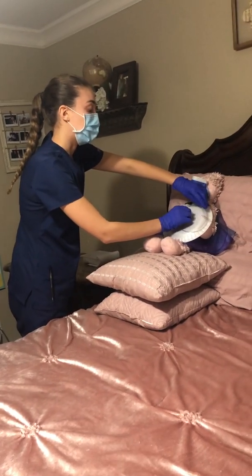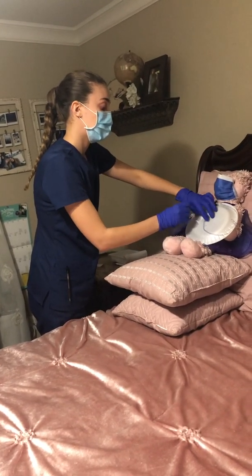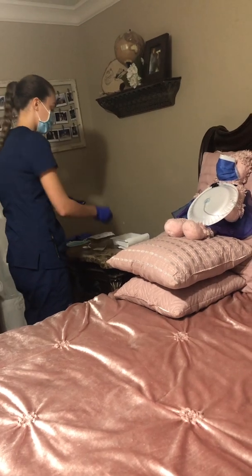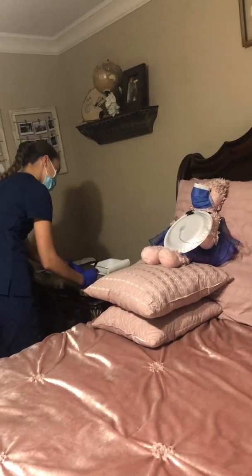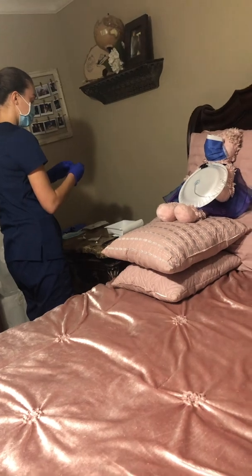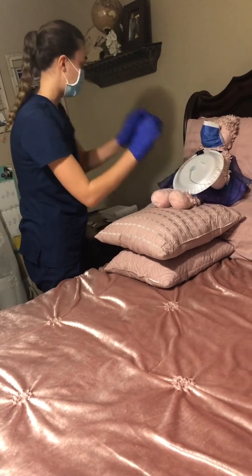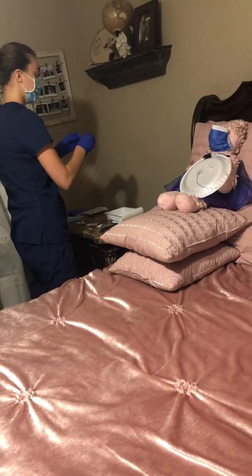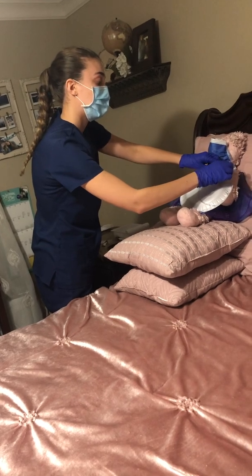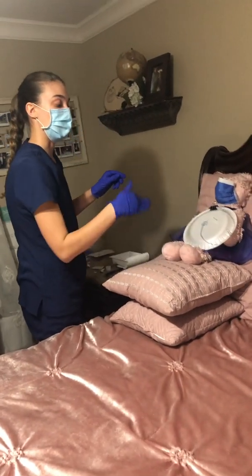Okay, I'm going to go ahead and remove the outer wrapper. Ready? I'm going to take this off. Write down my name, initials, date, and time. Okay, I'm going to place that on there. I'm going to get my tape. And tape just below the cap, away from the patient's face. Alright, once again, make sure that the caps are locked and this lock is locked so no air can come in or fluid can come out.